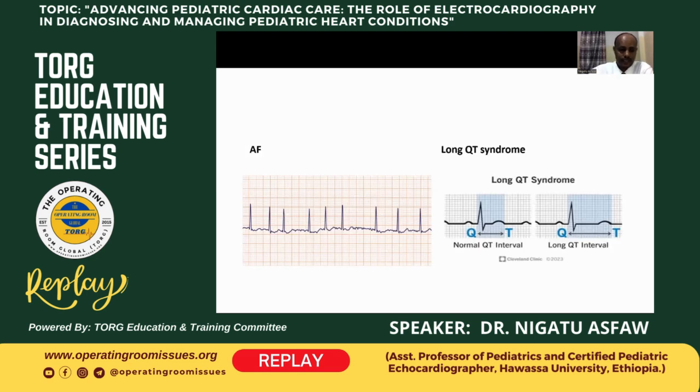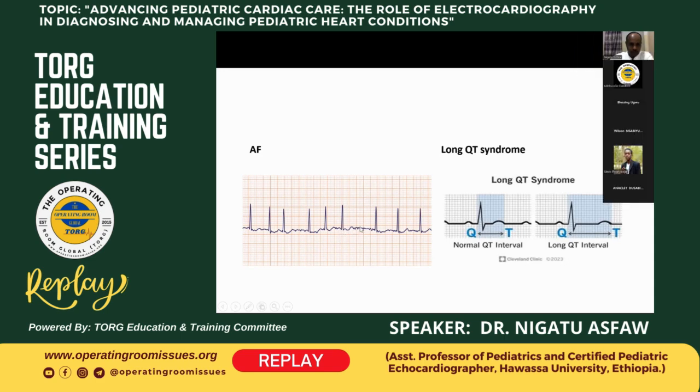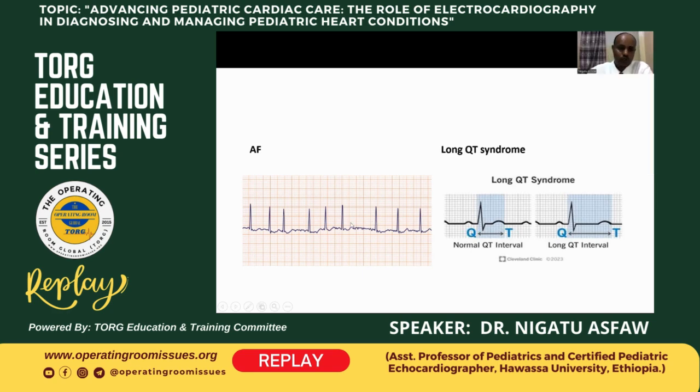And this is a picture to show atrial fibrillation. So these are the fibrillatory waves, and as you see, the RR interval is irregular, and there are no two intervals or RR intervals which are similar.